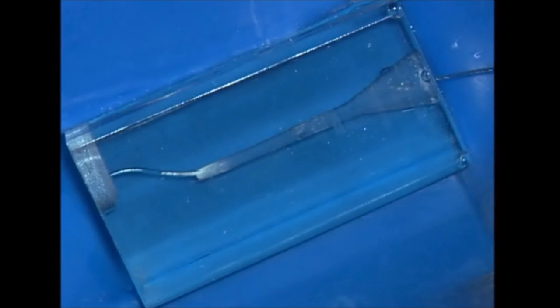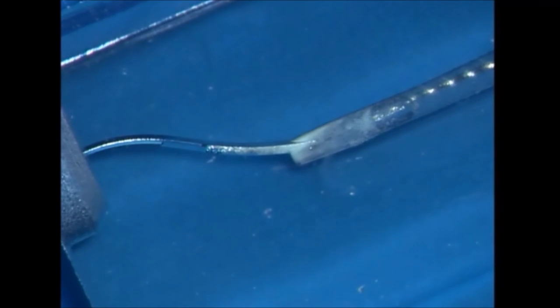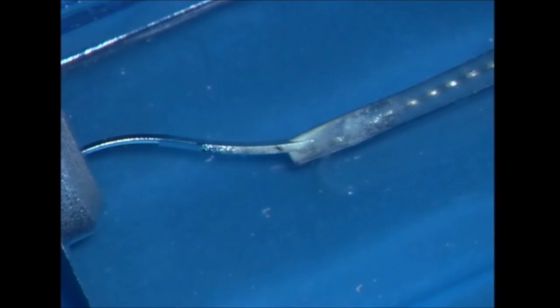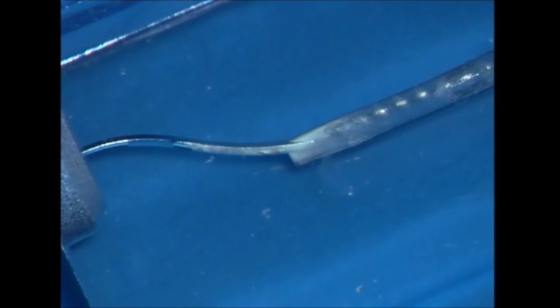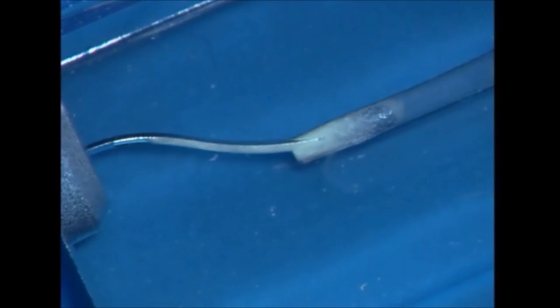A pre-enlarged canal allows a pre-curved file to be easily inserted down to the iatrogenic event. Notice in this orientation, the pre-curved file bottoms out on the shelf and is limited in its ability to move apical. With a little bit of orientation, the file readily drops through the debris, and again the short amplitude strokes move a lot of this debris into solution.